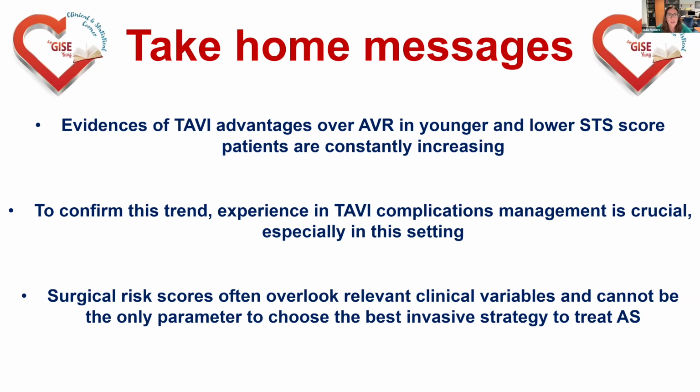We talk about a young patient, not so low STS, not so low risk patient in this case, but young. Speaking about adverse events, which kind of adverse events do you fear most in the short term and long term? For example, stroke or patient prosthesis mismatch?